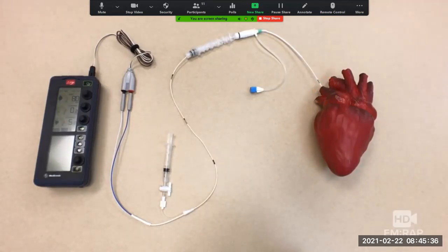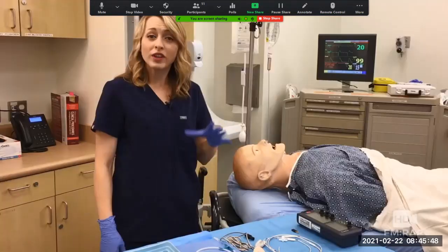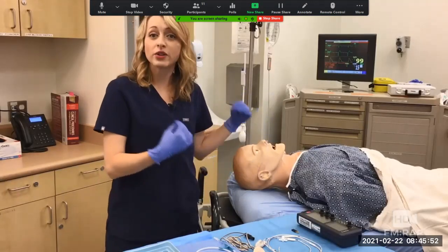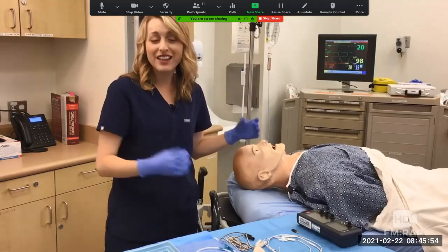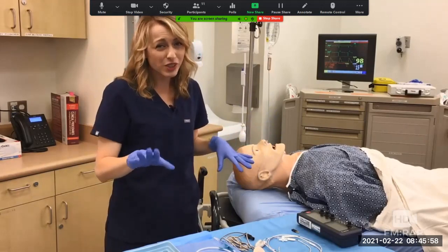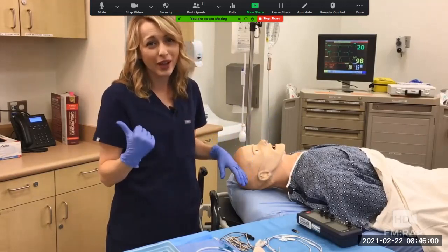You have a sterile sleeve over the top of the sterile pacing wire. This syringe inflates and deflates the balloon, and then through adapter pins, it plugs into the connecting cable, which goes into the pacing generator. So once you consent your patient, and we already had an informed discussion, you're going to sterilely prep and drape your patient, and then you're going to put in that right IJ line. I'm just going to assume y'all know how to do that part, so let's jump ahead.